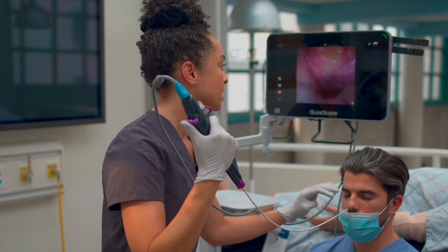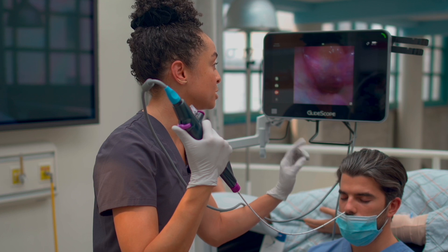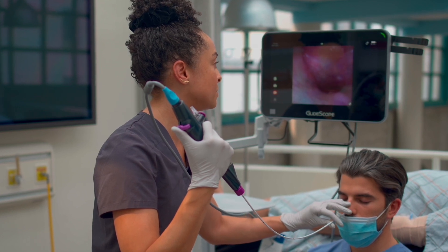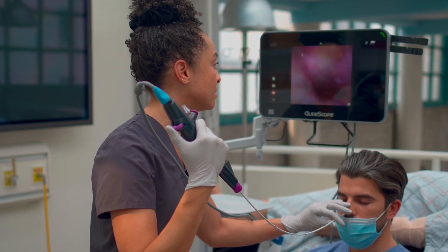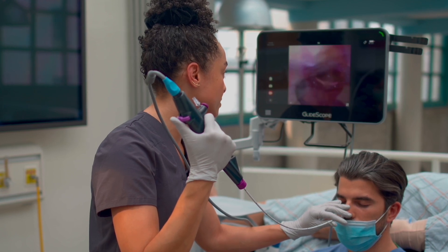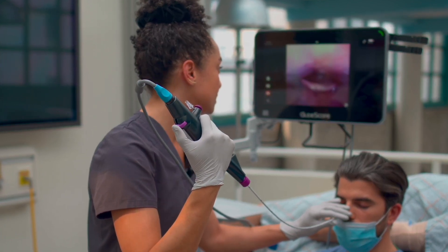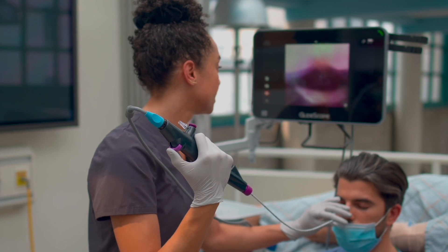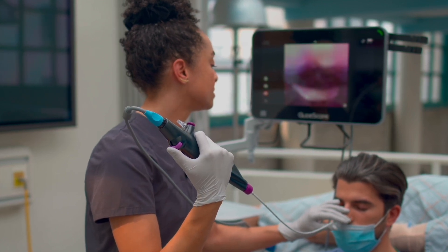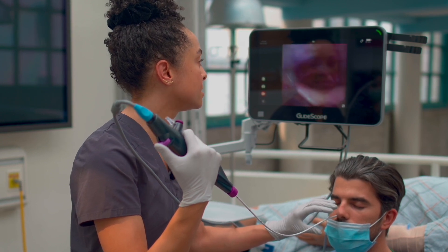Go ahead and just hum and relax. In other patients, humming opens up the soft palate a little bit if you're having any difficulty there. Go ahead and stick out your tongue — this is the base of tongue. Put your tongue back in.